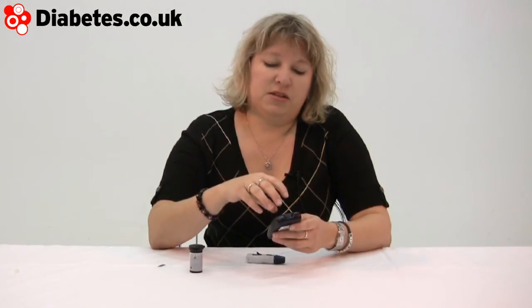Most meters have been doing this for a while, but increasingly something that meters are focusing in on is being able to tag mealtimes. So in order to see how your blood sugars go through the day, either before or after a meal, you can tag them.